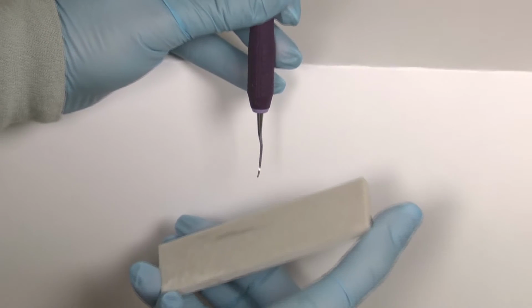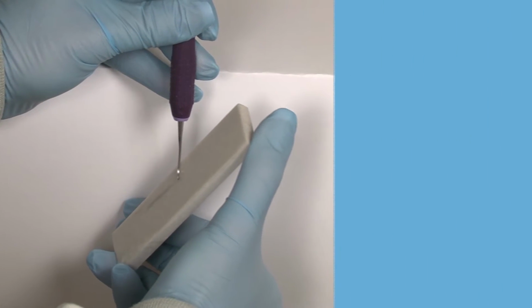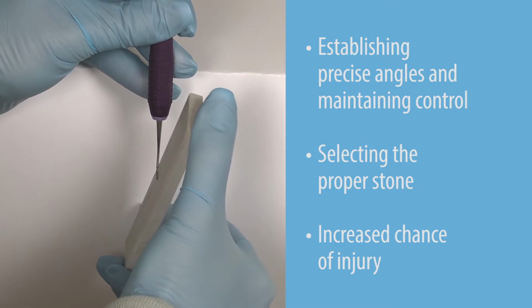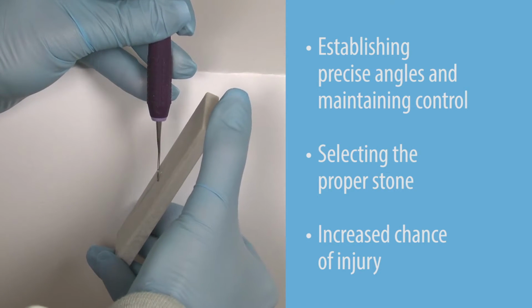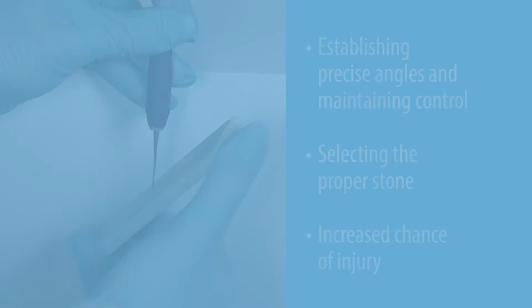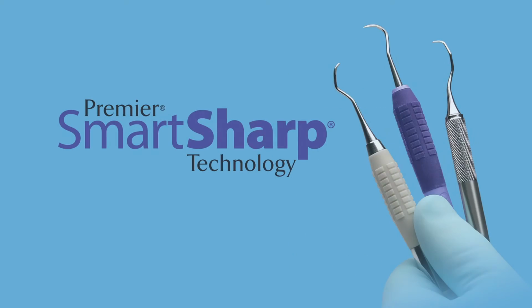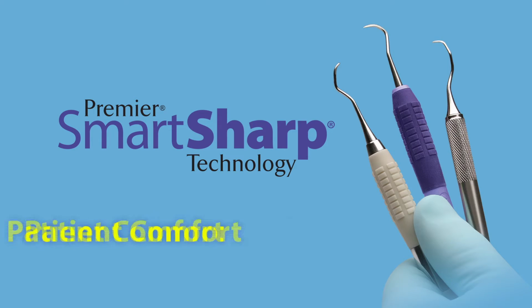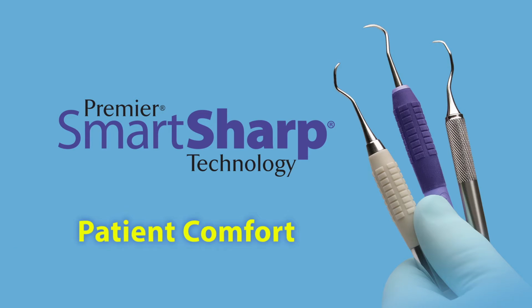Limitations when using a handheld stone include establishing precise angles and maintaining control, selecting the proper stone, and increased chance of injury. Sharp instruments keep you at peak efficiency while minimizing physical stress. Your patients will appreciate an efficient procedure with greatest comfort to them.